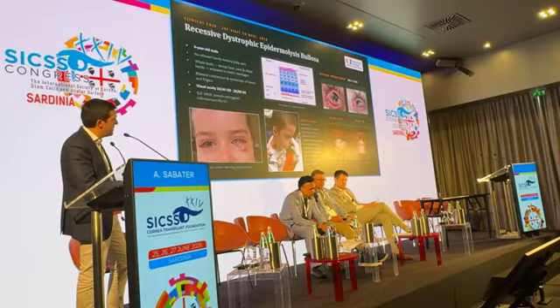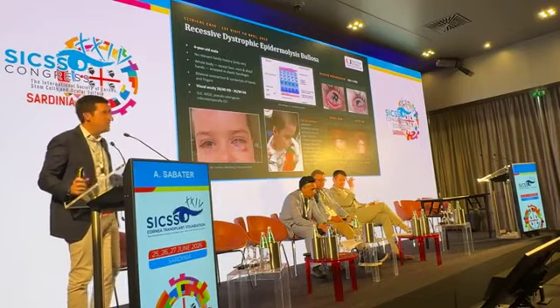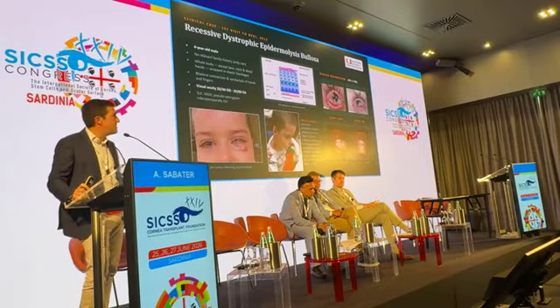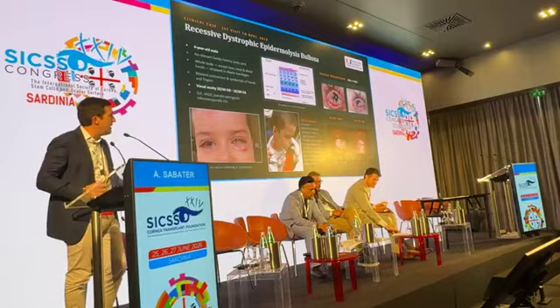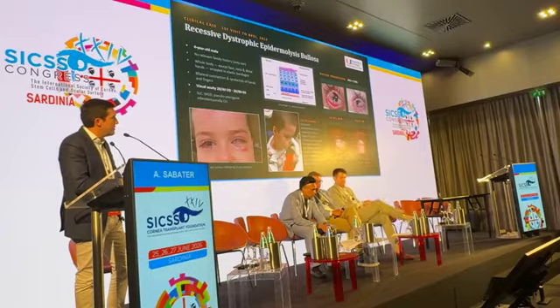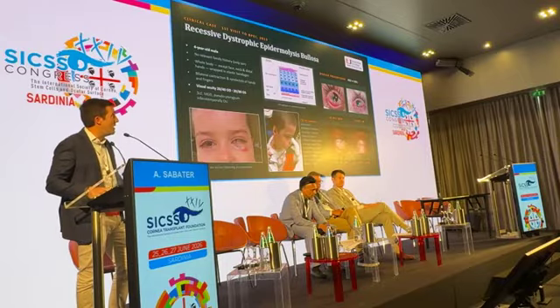So when we saw the patient in 2014, here you can see the first picture, actually already in 2015, we decided to do a couple of surgeries. First we started with just symblepharon removal, we did amniotic membrane transplantation, we did oral mucous membrane grafts, we did plasma-rich growth factor fibrin membranes, and the reality is that after 2 or 3 surgeries that were attempted in this eye, of course the symblepharon was just coming back, still was developing corneal ulcers constantly, and not only in the cornea but also in the conjunctiva, which I think is basically why this patient ended up having all these recurrences.